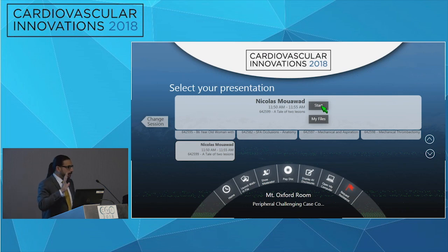Hey, you know what? We prepared the vessel appropriately for delivery of the drug with a Flex catheter at one point, and the other one without a Flex catheter, and we found that you get more dissection. So the alternate discussion is now, so you know what? Why are you using a Flex catheter? Why don't you use a scoring balloon? Well, this was the whole particular reason. In the scoring balloon, you have a lot of the balloon effect that causes more dissection in order to push through or break through the plaque with the scoring mechanism. Versus in this scenario, you're just causing a micro dissection or micro incisions in order to deliver the drug into the intimal layer.